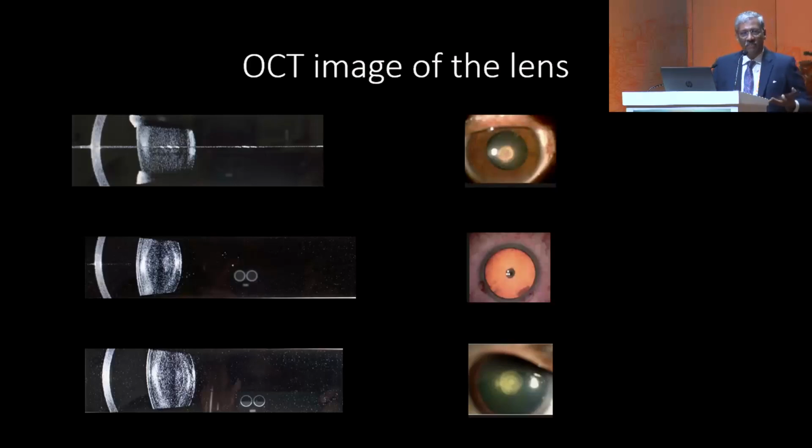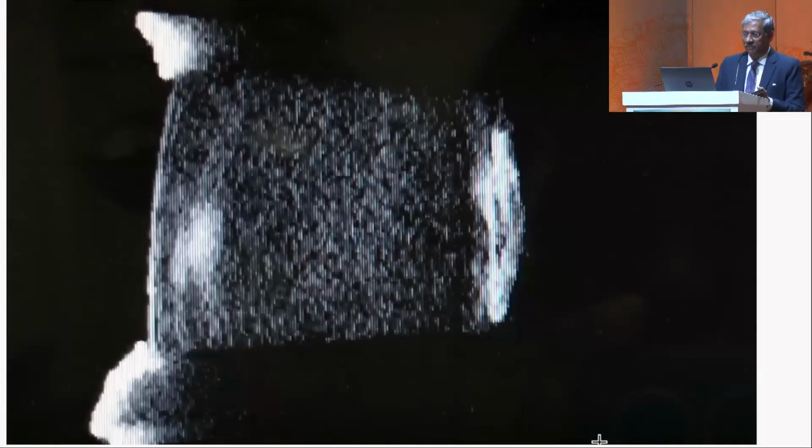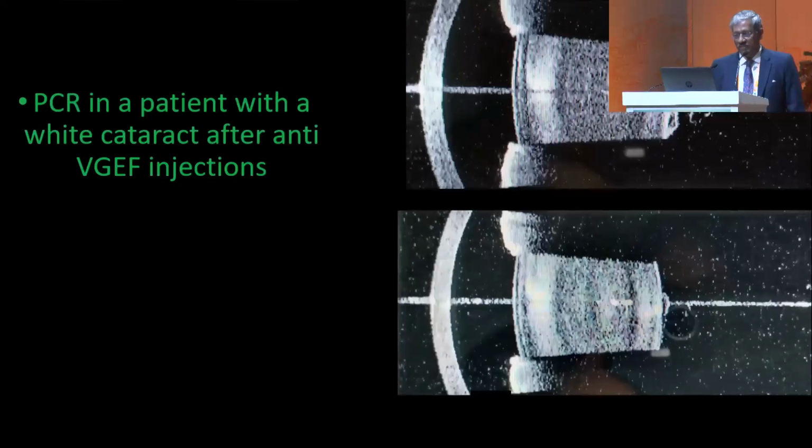We all deal with posterior polar cataracts, and we are worried that we're going to have a problem intraoperatively. But when you see a beautiful posterior capsule like the second and the third, we don't have to discuss the risk of PCR with these patients because they'll have a routine intraoperative procedure. This is an IOL Master lens picture from a patient with a posterior polar cataract where you can see a nice bulge of the posterior capsule. So this patient probably will have to have the discussion about increased risk during surgery.